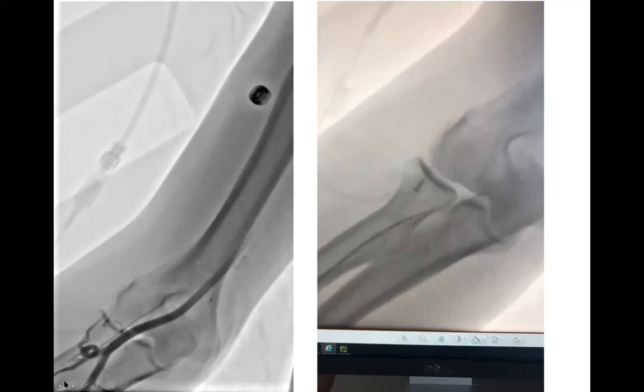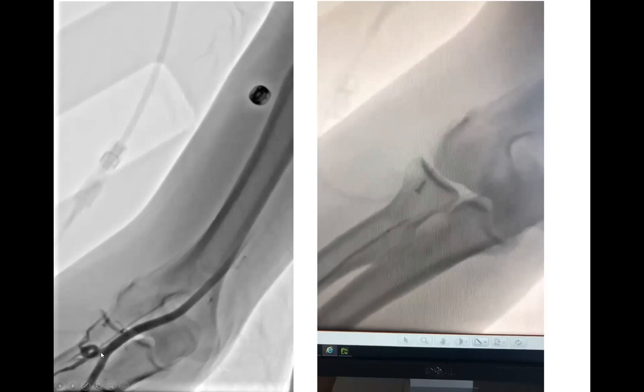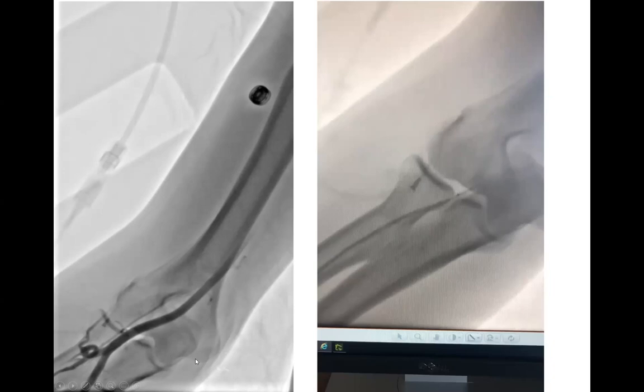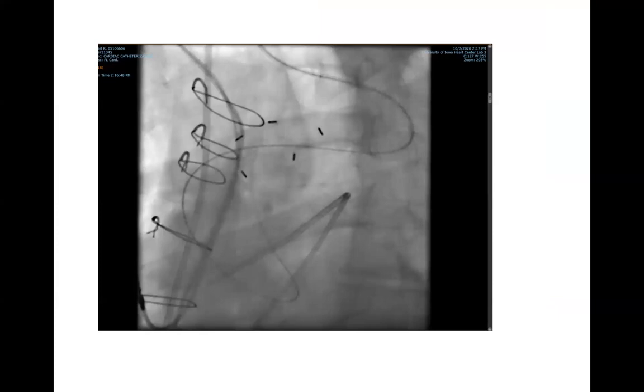This particular patient had two bad things: the radial loop, seen in about 2.5% of right radial procedures, and accessory radial artery, seen in about 7% of radial procedures. Both are major hindrances to radial approach success, and this technique works well in general.